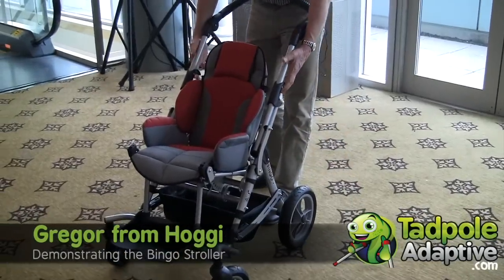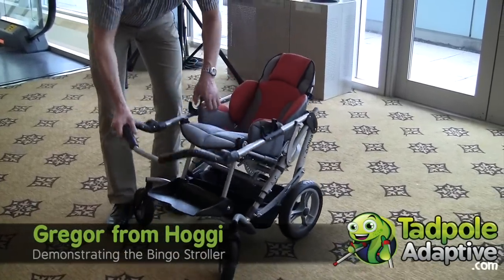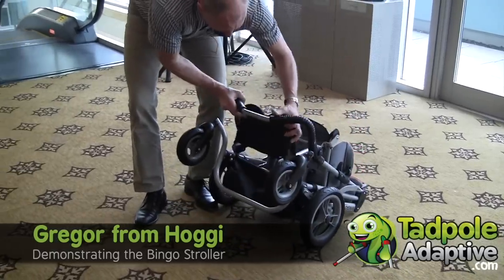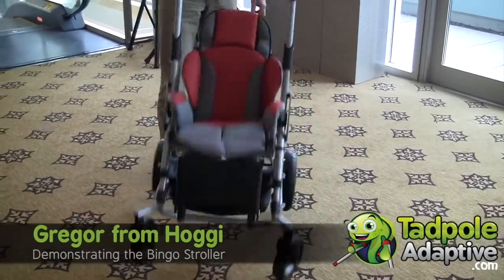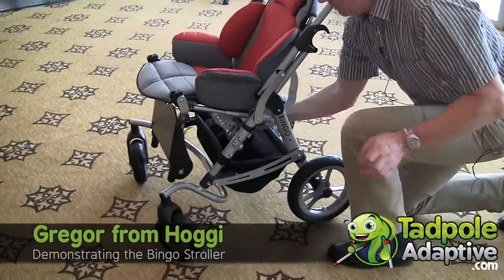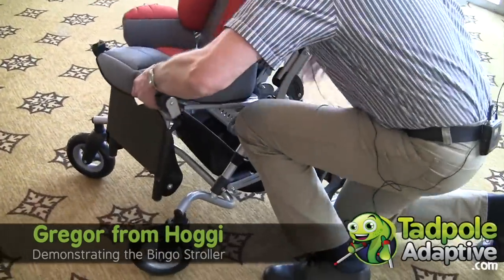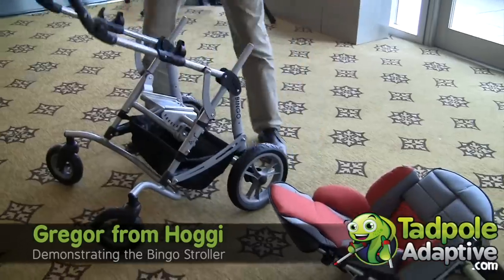We can fold it with the seat on — like this. Or you can take the seat off. There is a little knob underneath — you push it and take the seat off. And then fold it.